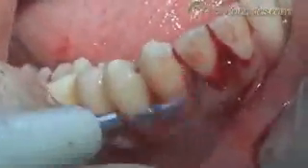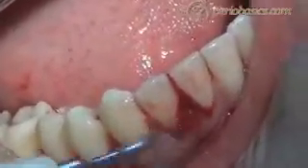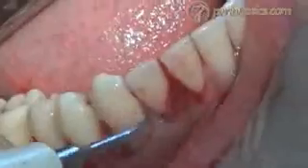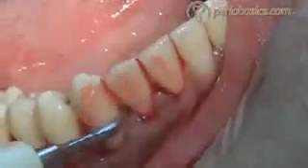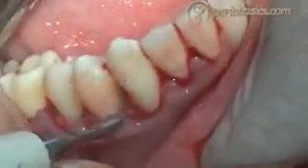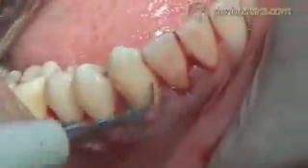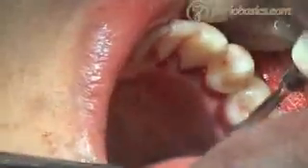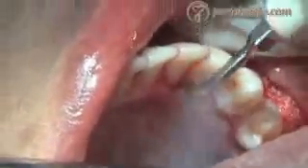The main advantage of modified flap operation is that it preserves maximum healthy tissue, removing only the infected pocket lining. As you can see, scaling is done on the buccal aspect, and the same procedure is repeated on the lingual aspect.